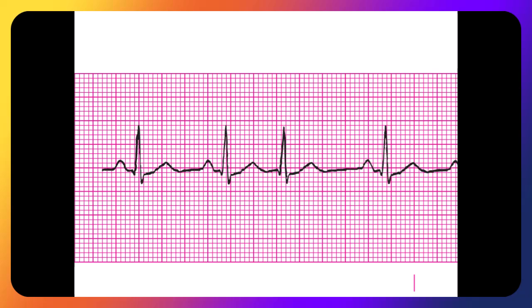On the PJC, do you see a P wave? Braden. Here's the thing. If you tell me no, Skylar, I'm okay with that. Braden, if you tell me you think you see a small P wave in there, I'm okay with that too.